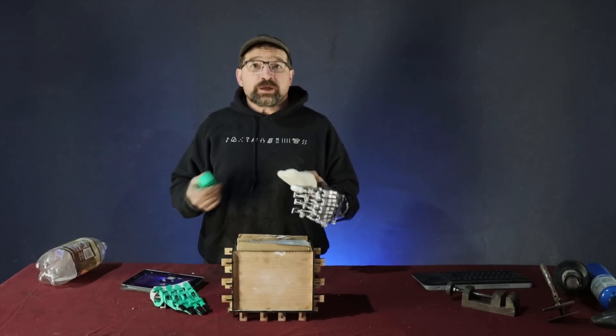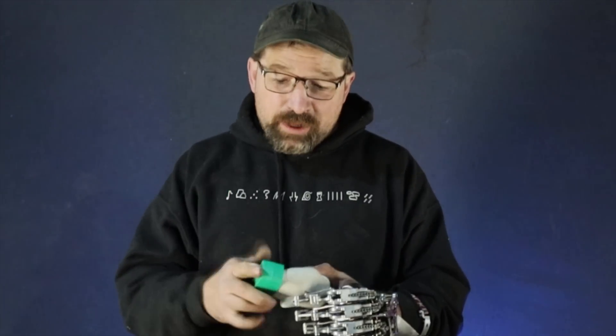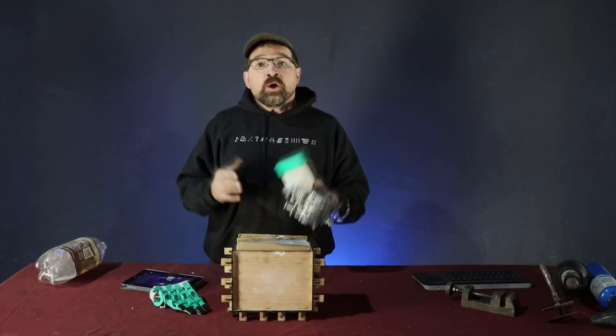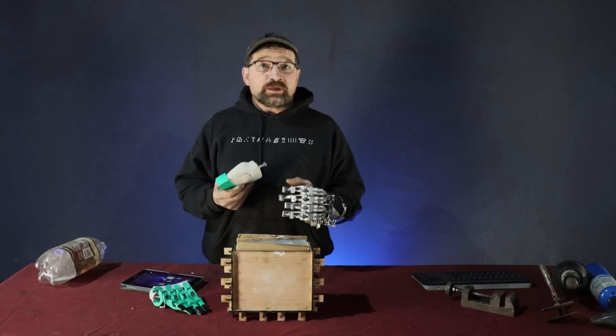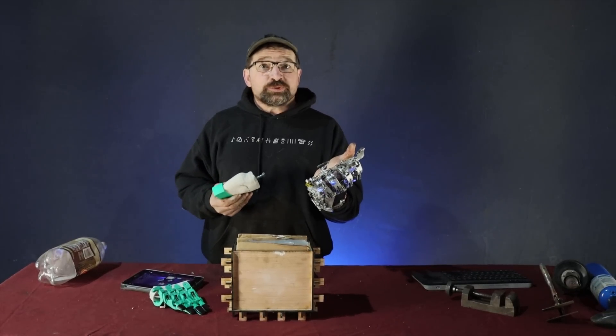Once I have the plaster buck close to its final shape I'll go ahead and print this interface check block to make sure that the metacarpal plates are going to fit and I'll have the right alignment. Once the check block fits nicely and you're happy with the overall shape of the buck, it's time to make a check socket to make sure that the shell produced by this plaster is going to fit your residual limb.